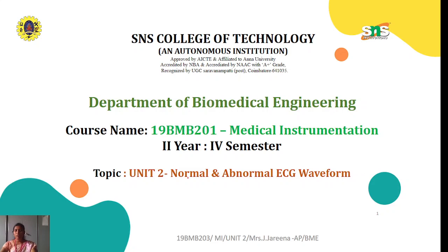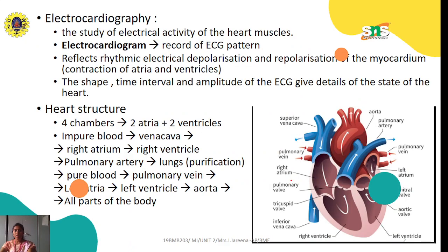Hi all. Now we are going to see the second unit. The first topic is normal and abnormal ECG waveform. Okay, so first we should know what is meant by ECG. ECG means electrocardiography.